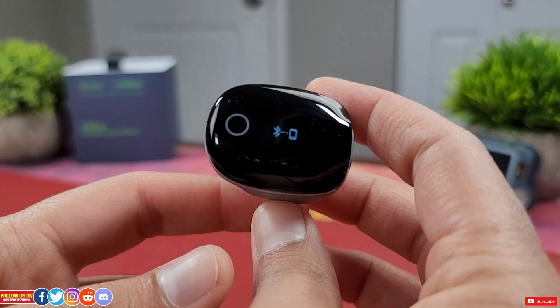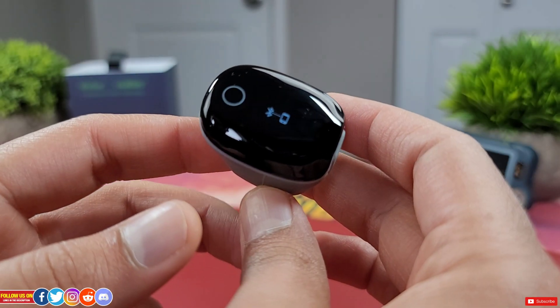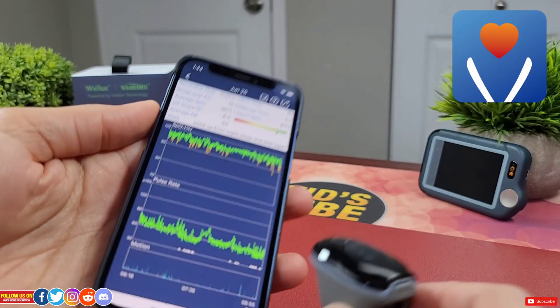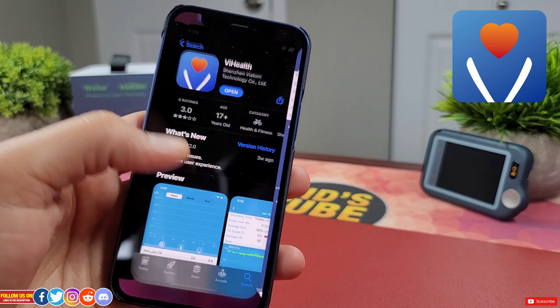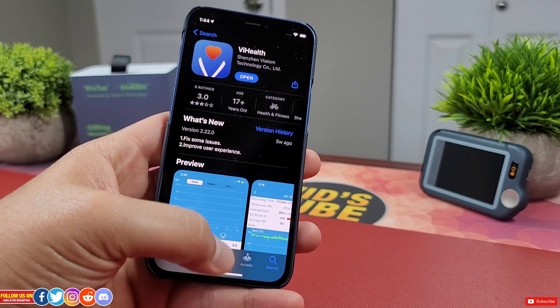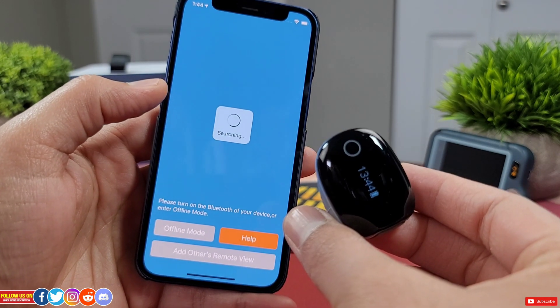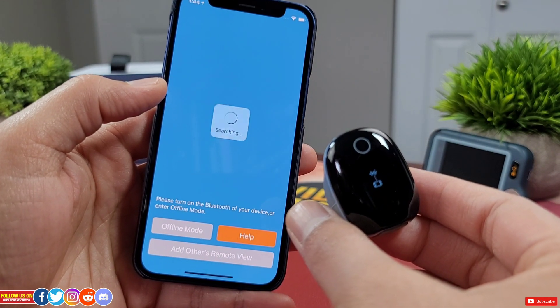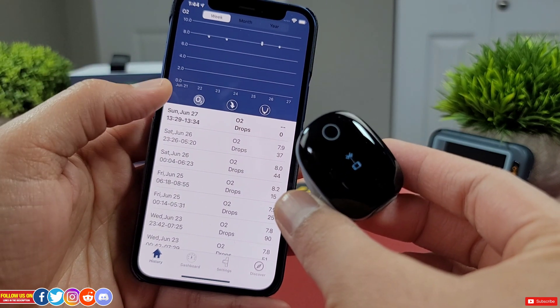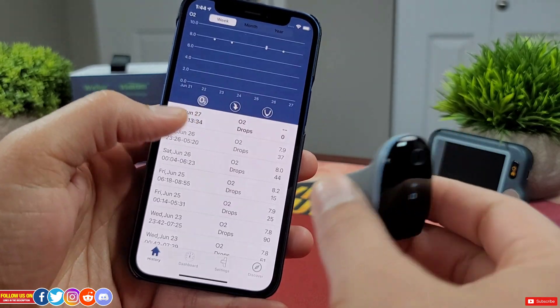Let's talk about how to transfer readings and set this device up with a smartphone. You have to download the V Health app, which is available for free on both the Apple App Store and Android Play Store. Once the app is installed, it will start searching for nearby Bluetooth devices, and the O2 ring should pop up — that's it. You don't have to go into the Bluetooth settings of the phone to pair it; it's all done right from the app.